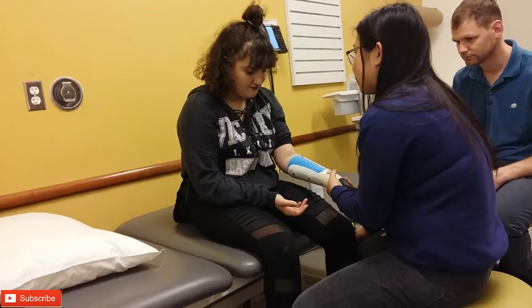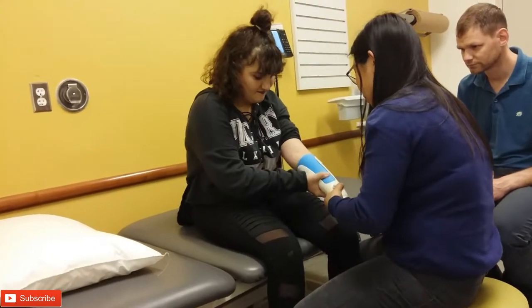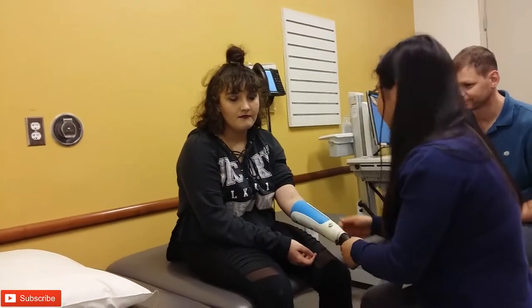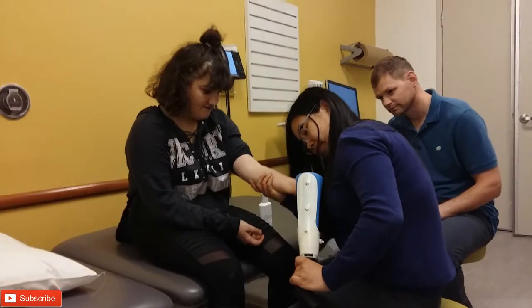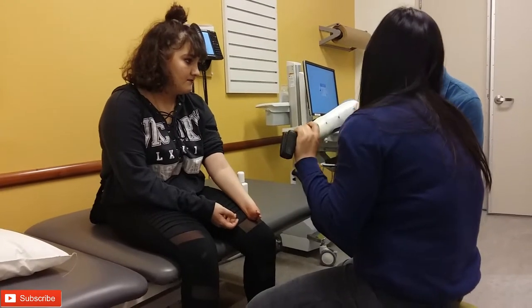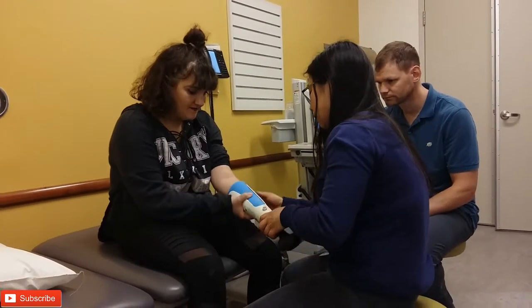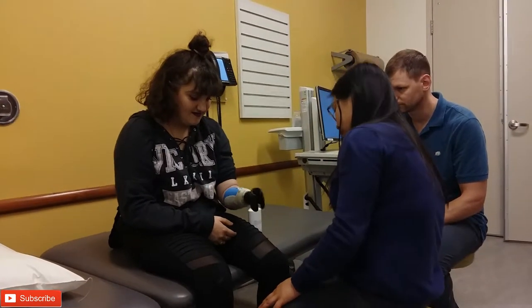I'm going to try to pull on it and see if it stays. What is that noise? It's a vacuum. Because the silicone is not fully saturated — it's saturated at the bottom. But other than that, Aaliyah, is it pretty uncomfortable? Yeah, this one is comfortable. You could show yourself wearing that for a full game.